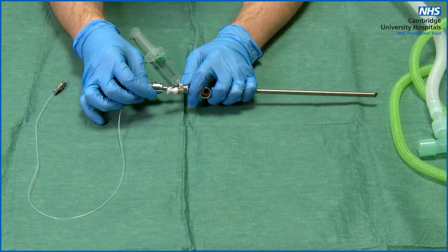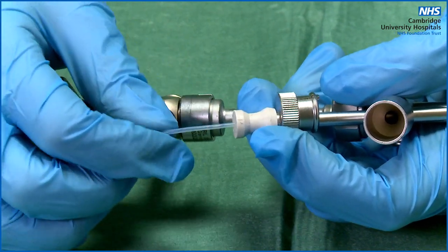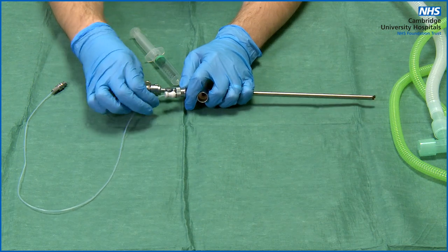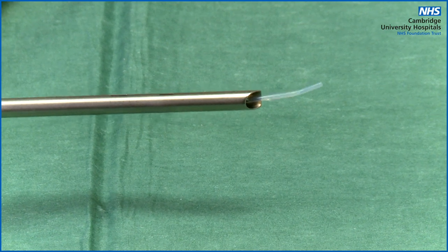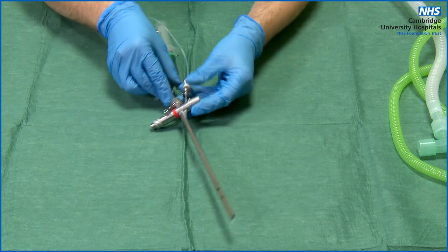With the suction catheter, push the catheter through the bung on the suction catheter guide and keep feeding it down until it comes to the end, then pull it back so that it doesn't protrude at the end of the scope. If you are struggling, you can remove the bung to make it easier to pass the suction catheter.